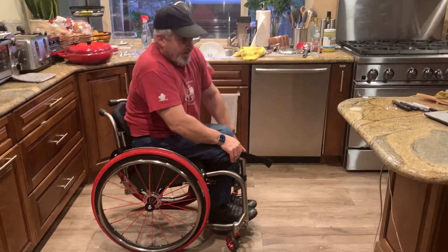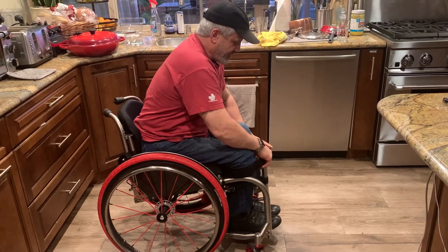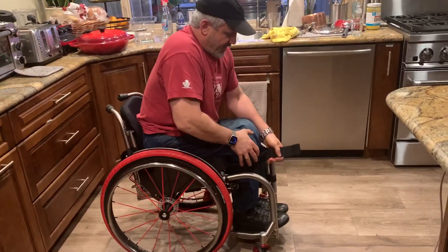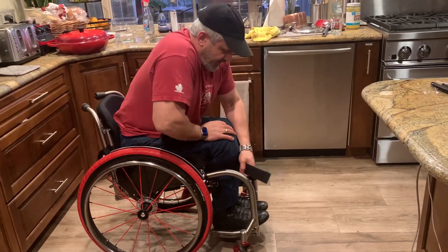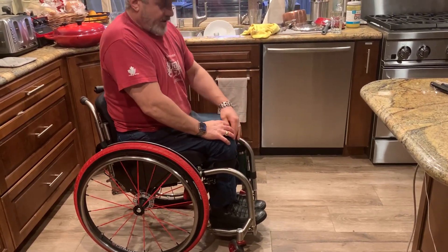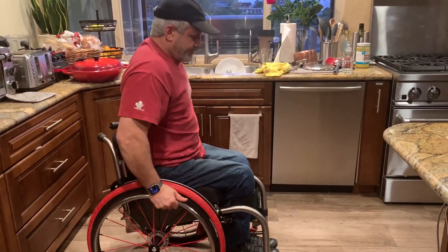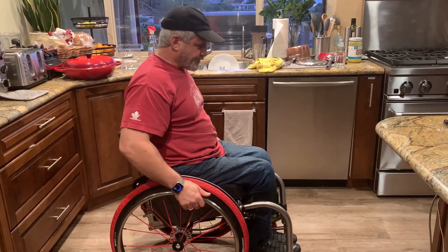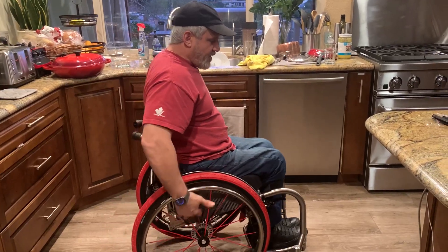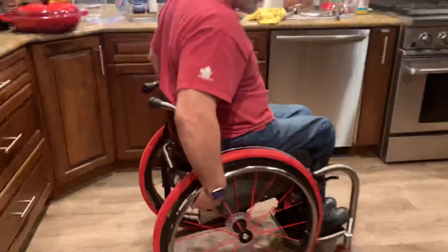These straps fold away nicely so they're not hanging out all over the place like my other chair. The main thing is going to block the knees — later on I might put a little foam on here, maybe a foam separator on my knees. That might happen later.